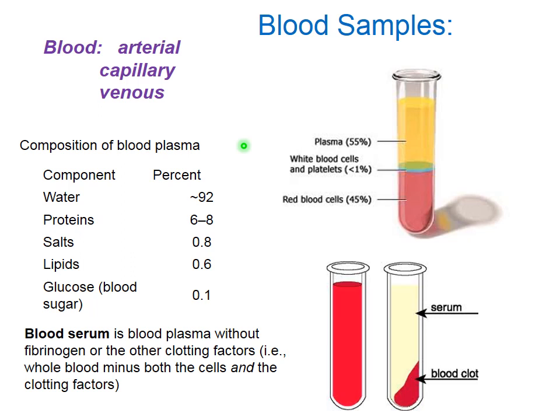Now, very common blood samples are serum. What are these? It's just blood left standing on its own, so you have a blood clot, and above that is an almost colorless liquid we name serum, and actually its volume is smaller than the total volume of all the blood. So that's what you had before, that's what you had after.